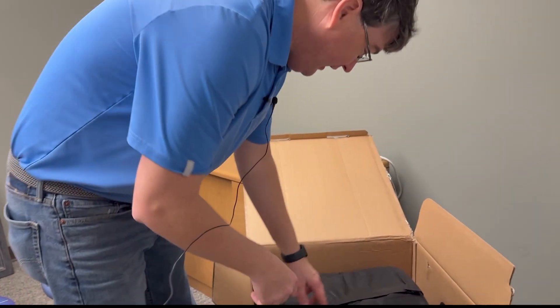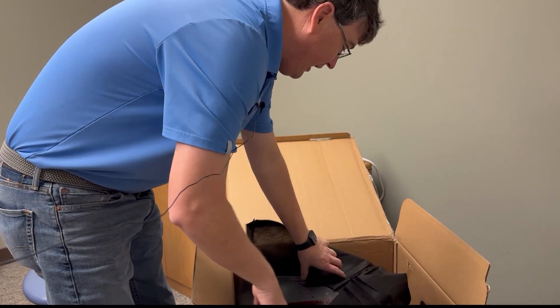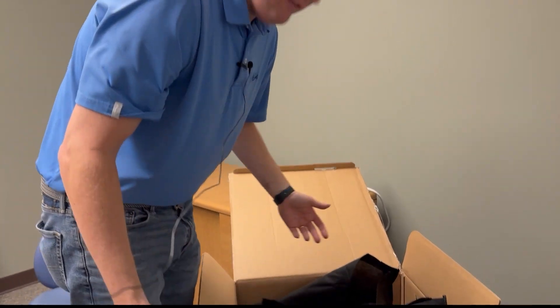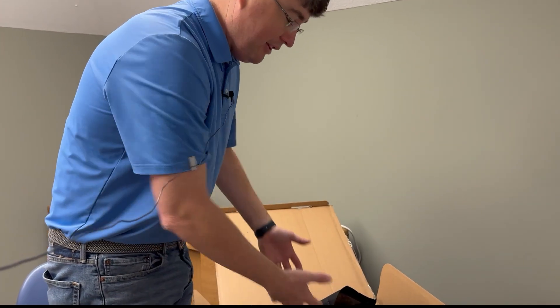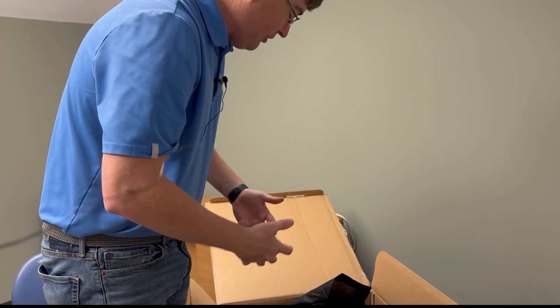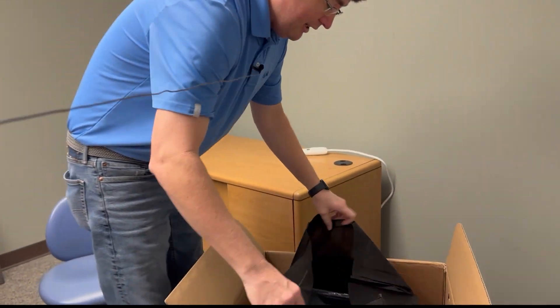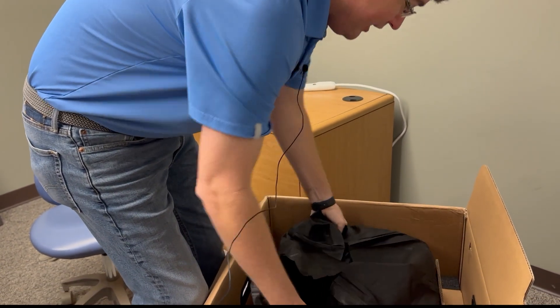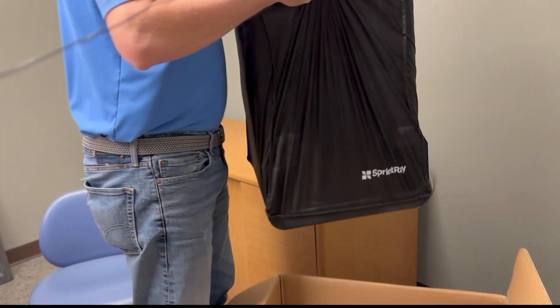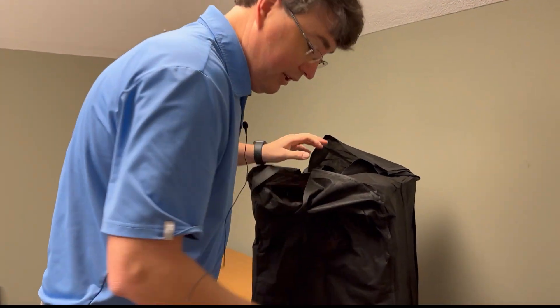These things are heavy, so you've got to be able to pick them up out of this cumbersome box. Sprint Ray puts this little cloth sack around it, so let's pick it up — yeah, it's not too bad. Let's set it on the counter.